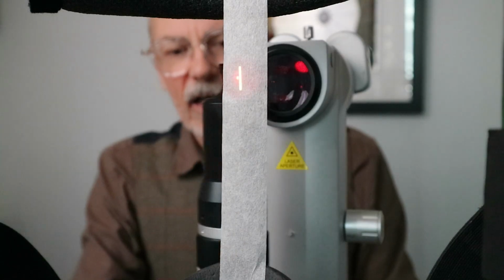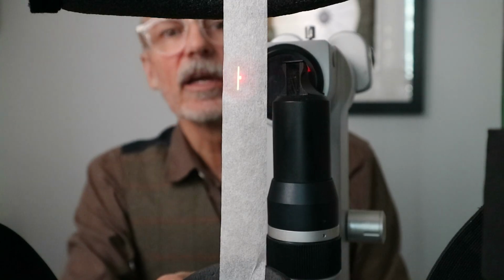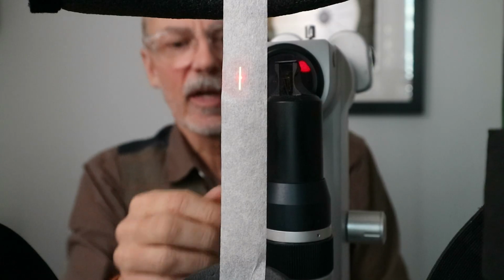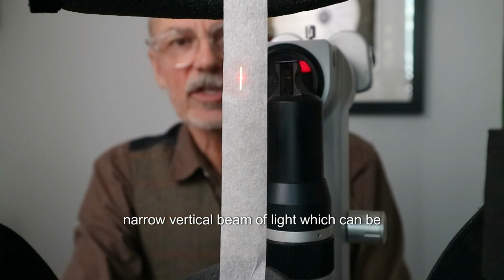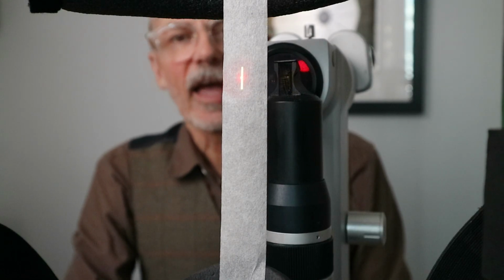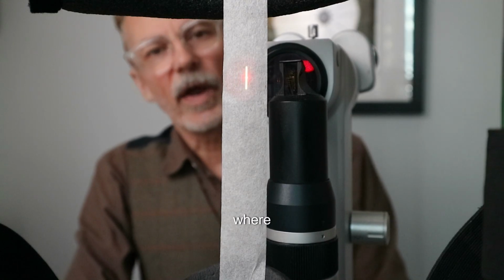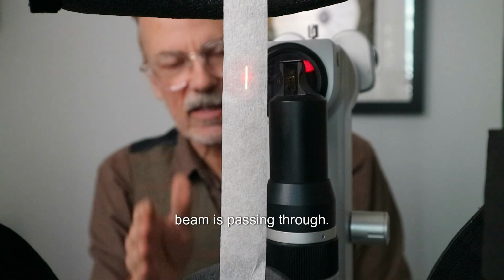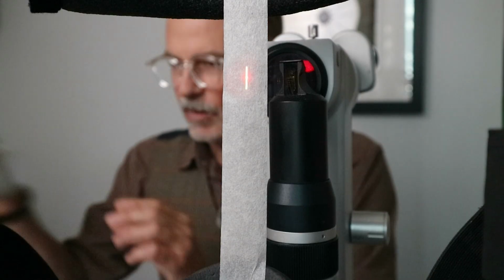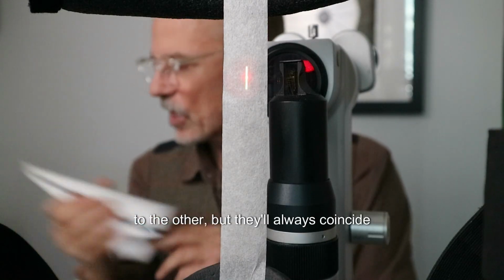Coincidentally, literally, the axis of rotation of that light illumination tower coincides with that focusing. So from this laser here, this is just a piece of tape I put up there, but there is a narrow vertical beam of light which can be widened. It can be made brighter. I dimmed it way down here. And what you would see is that those two red beams will come together right exactly where that beam is passing through. So both the light energy coming through at an angle as well as where those beams are focused, that's the precise location. And you might swing it off to one side or to the other, but they'll always coincide with each other.